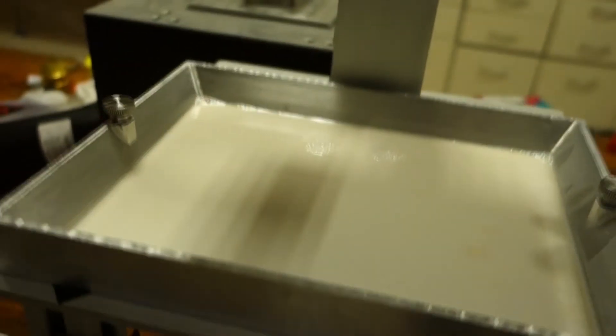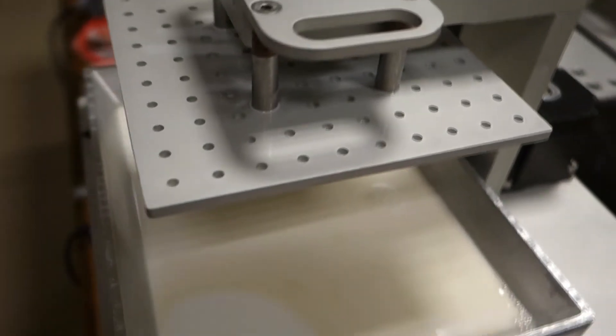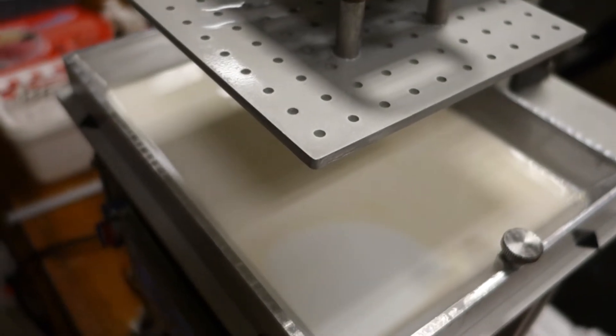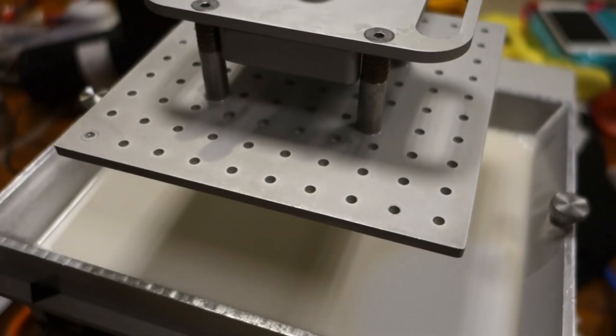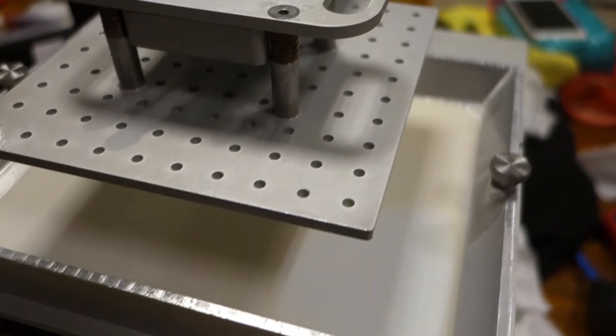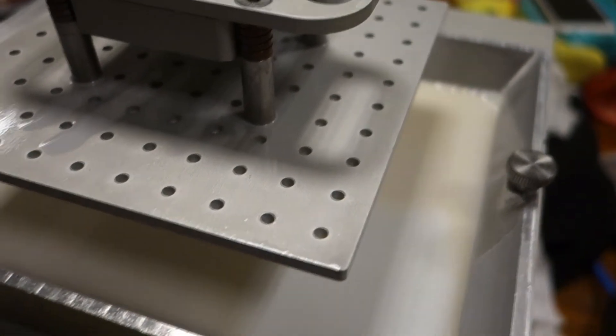We add a little more resin to fill it up — we're using white dental resin. We just wanted to show the process of adding it. After that, the 3D printing process starts. It is a slow process unfortunately, but hopefully 3D printers will print faster in the future. The printing begins once we've loaded the model from our computer.